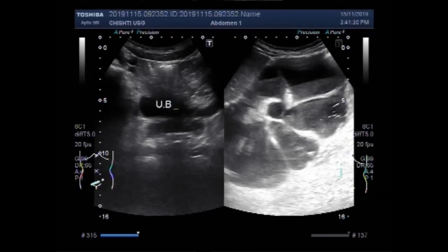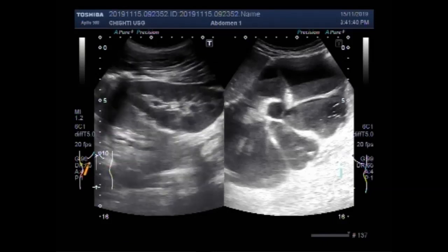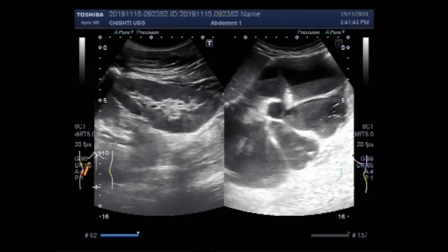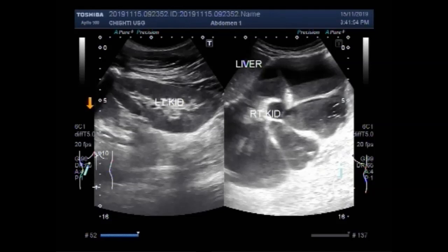Now you can see the left kidney and this is the right kidney, this is the left kidney, the liver, and this is the plane.